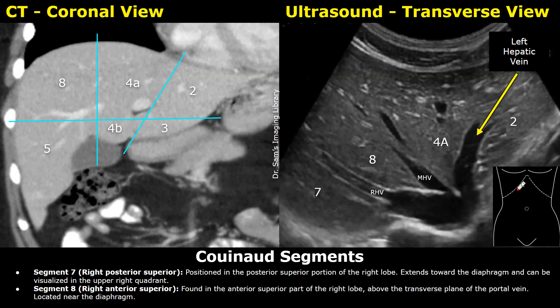You get this image when you place the probe parallel and just below the costal margin — you can see all three hepatic veins. The left hepatic vein is between segment 2 and segment 4a. Segments 2 and 4a are in contact with the diaphragm. Segment 4a will be between the middle and left hepatic veins. Segment 8 is between the right and middle hepatic veins. Segment 7 will be seen between the diaphragm and the right hepatic vein. The probe is angled towards the patient's right shoulder, so we are seeing the superior parts of the liver at the lower half of the image.